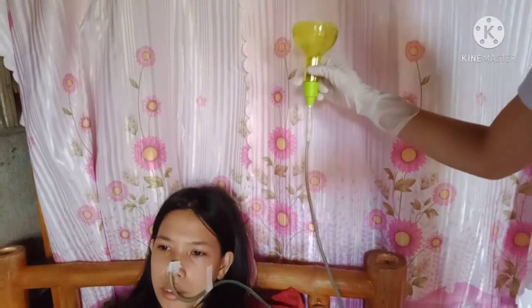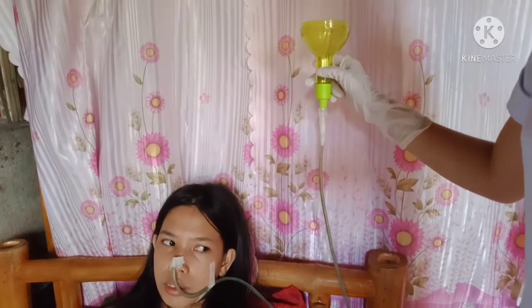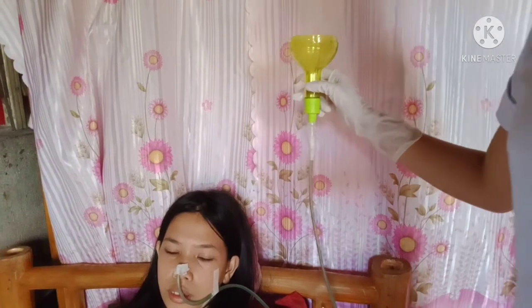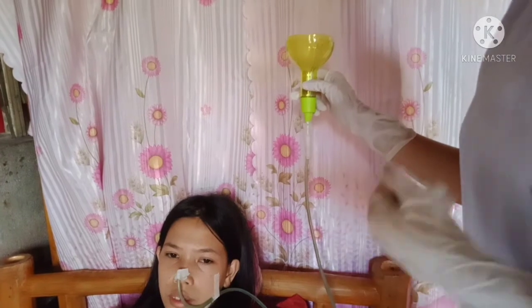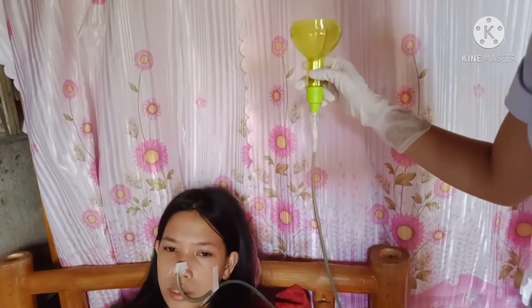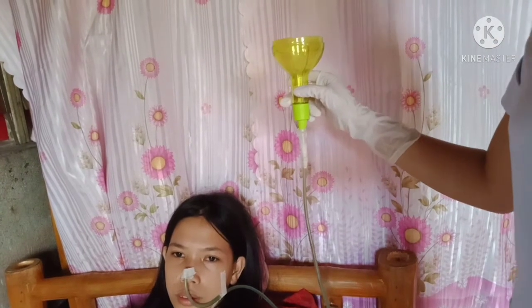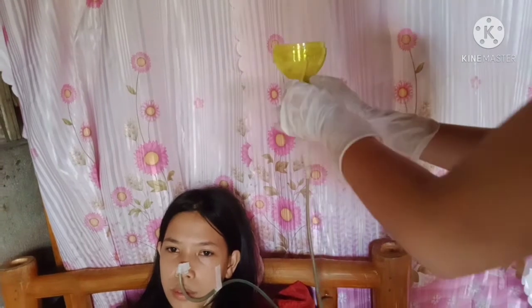If a feeding bag is used, hang the feeding bag on an IV pole, fill the bag with the prescribed amount of formula, and allow the bag to empty gradually over at least 30 minutes. So, gradual emptying of tube feeding by gravity from a syringe or feeding bag reduces the risk of abdominal discomfort, vomiting, or diarrhea induced by bolus or too rapid infusion of tube feeding.